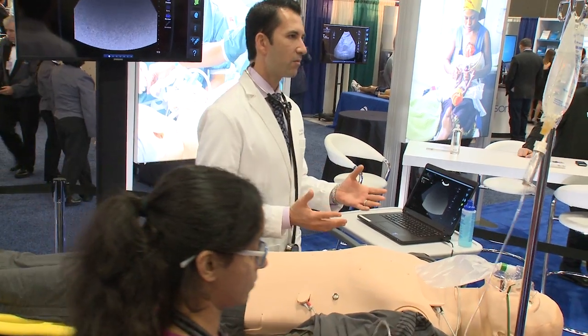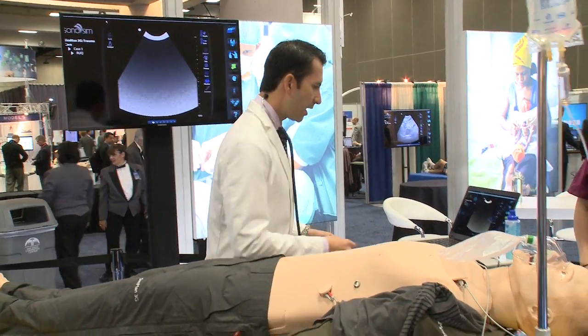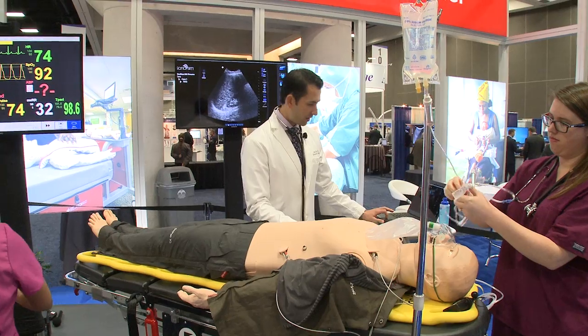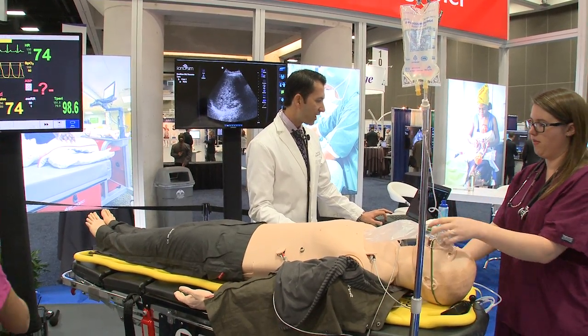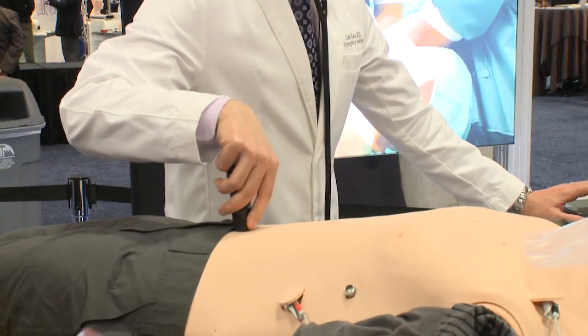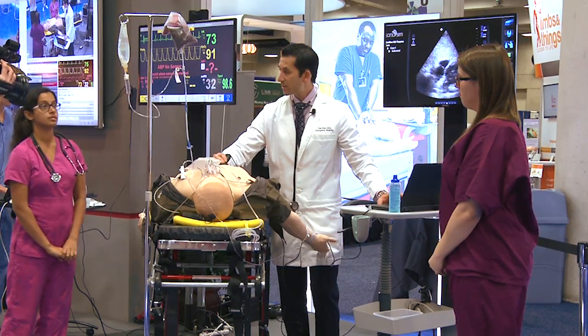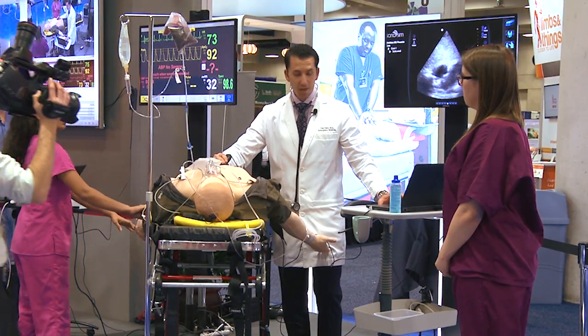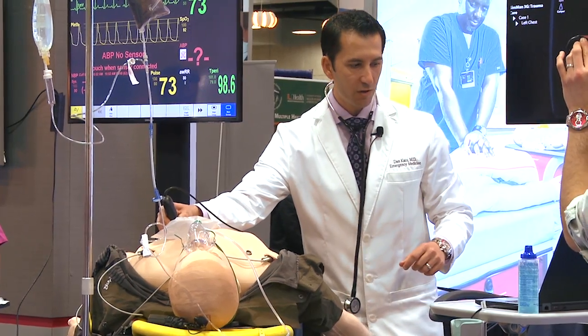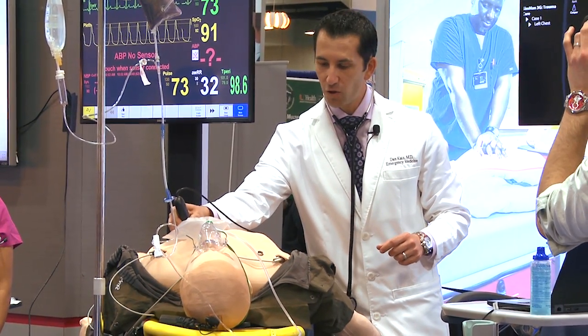This really replicates what I would do in a real emergency department case. We look for fluid in his abdomen, scanning the right upper quadrant for fluid between the kidney and the liver. We scan down into the pelvis to see if there's any fluid accumulating around the bladder. We look between the spleen and the kidney — nothing there. Next we look at the heart for any evidence of fluid accumulating around it preventing it from filling — not from there. We check the left chest for any evidence of collapsed lung — it looks normal.